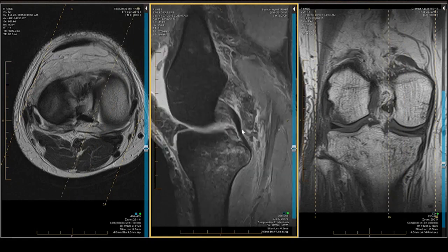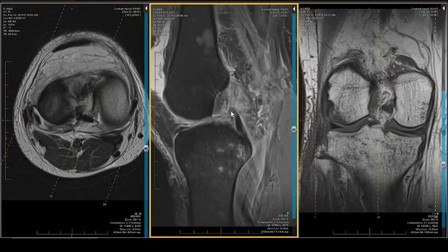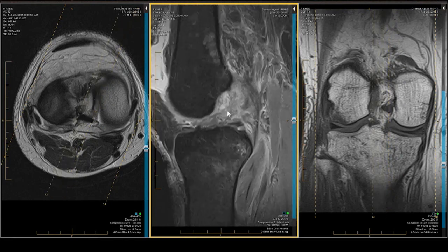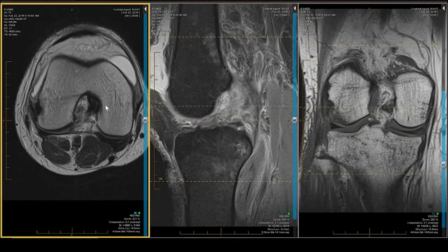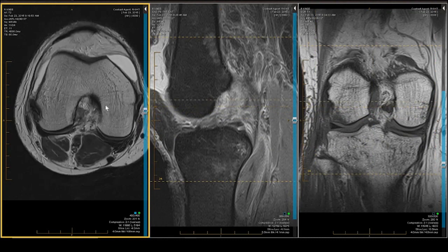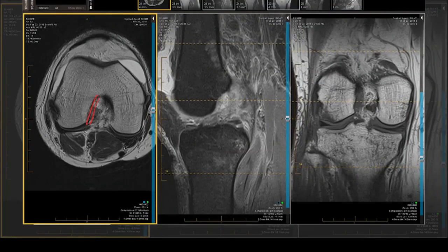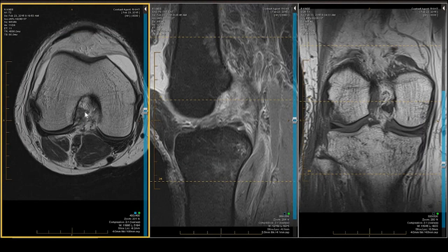There is our posterior cruciate ligament. Working to the lateral side, there is our demolished, pulverized anterior cruciate ligament — consistent with a pivot shift injury. We can also see this on the axial projection: the paired fractures in the back tell us there has been a serious shift of femur relative to tibia, and the ACL, which should be a linear straight structure, is just a big gray blob — totally fibrillated and pulverized.